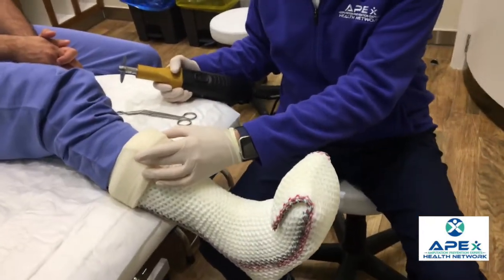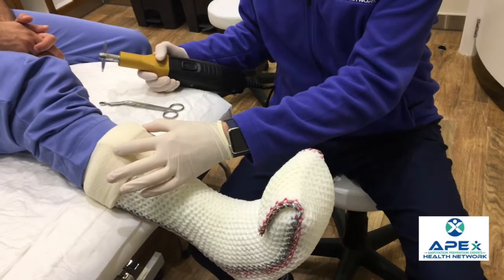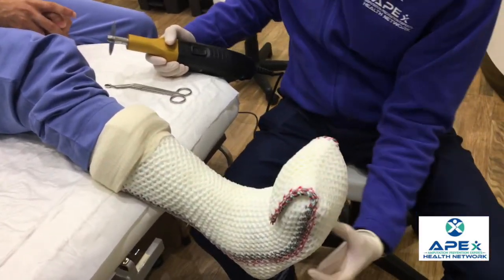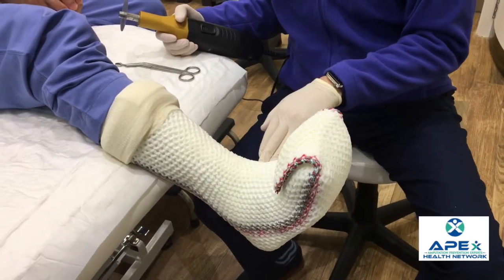Because of the way the TCC-EZ is designed, there is padding that goes down the anterior crest of the tibia, over the foot and plantarly, and also over the malleoli.